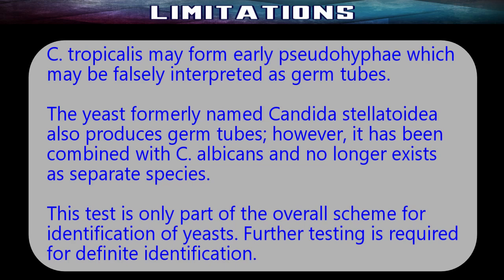This test is only part of the overall scheme of identification of yeast. Further testing is required for definite identification.